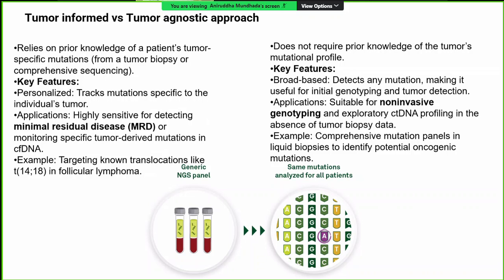profile. Here we have only a blood sample or a bone marrow sample to detect any mutation. And this would be a broader testing as compared to a tumor-informed approach. And this is useful for non-invasive genotyping or exploratory analysis for such patients.